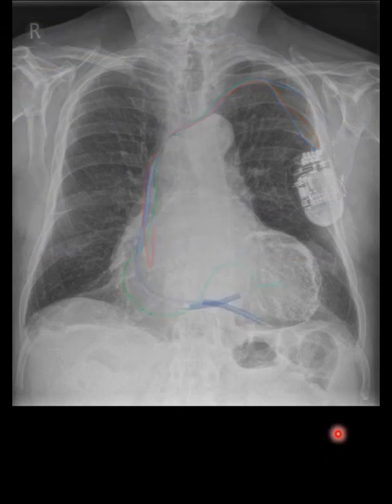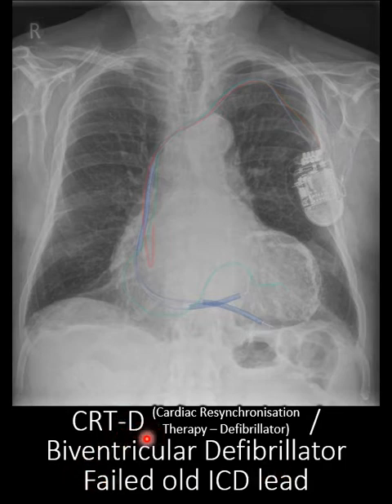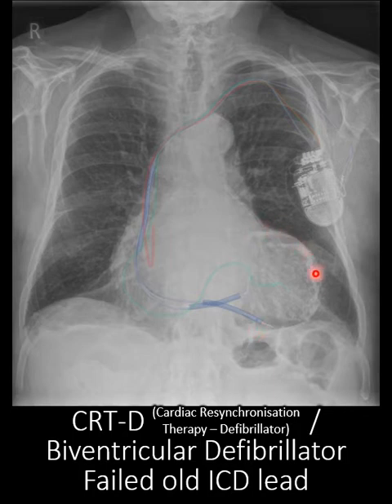Now there are quite a few examples to look through and decide what sort of device each is. This one is a cardiac resynchronization therapy defibrillator, often called a biventricular defibrillator, and there's a failed old ICD lead. You can also see here that there's an LV aneurysm which is heavily calcified — this patient has had an old anterior infarct.